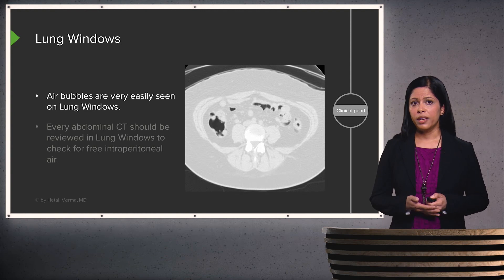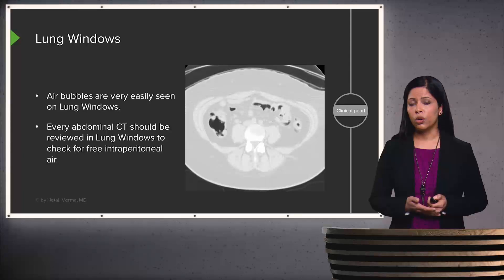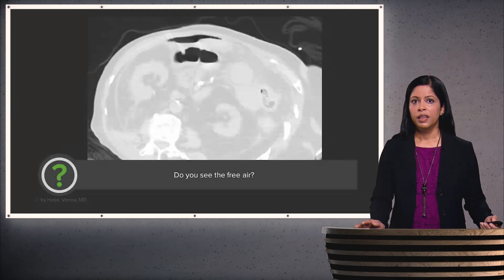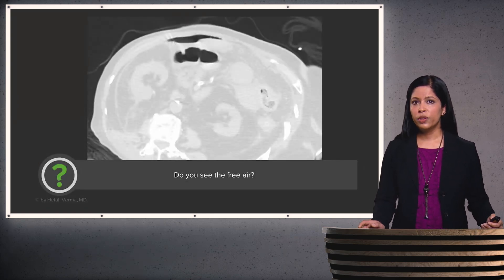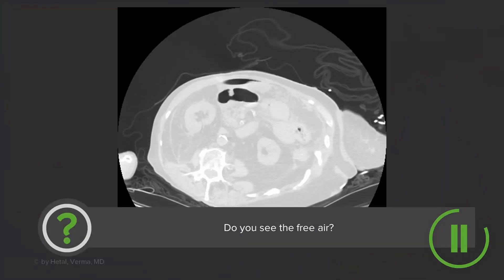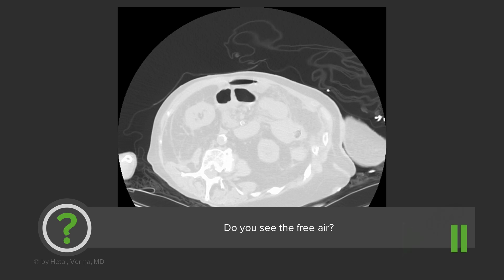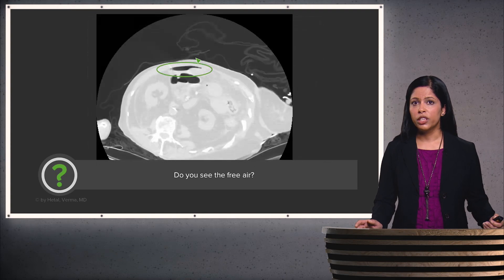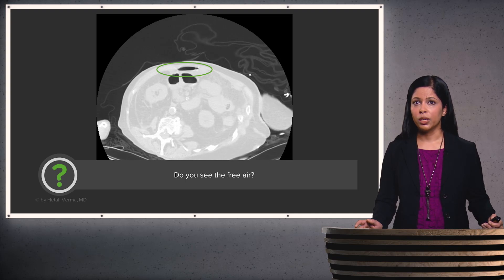Lung windows are very useful in identifying small air bubbles. Every abdominal CT should be evaluated in lung windows to look for free intraperitoneal air or abnormal collections of air. On this single slice, you can see air located within the bowel. When identifying free air, compare it with air located in the bowel wall — the free air is outside of any structure, whereas bowel air follows the bowel wall. This is how you identify free air when looking through lung windows.